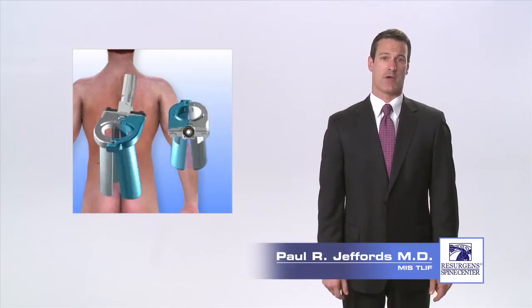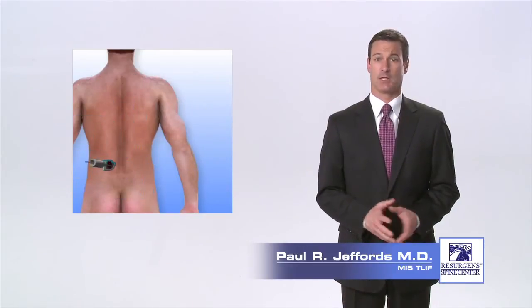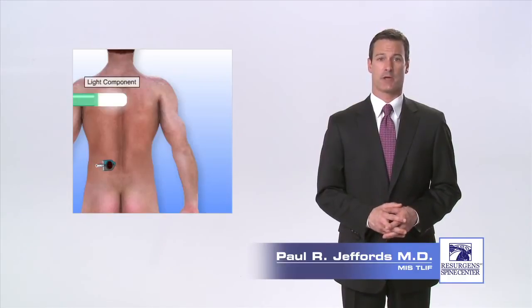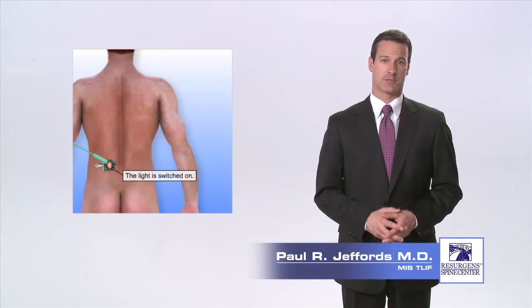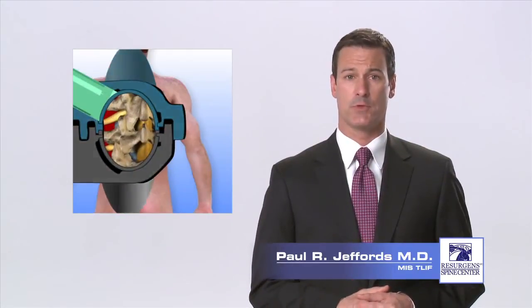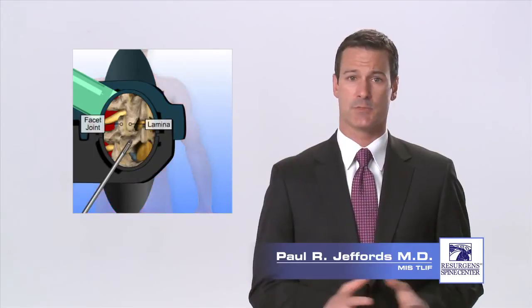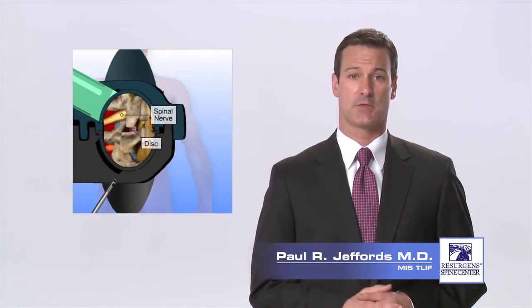A retractor is then placed over the final tube to hold the muscle tissue, and the tube is removed. A light source and possibly an endoscope or microscope may then be attached to the retractor to provide visualization for the surgeon during the procedure. Through the retractor, your surgeon is now able to remove the facet joint and any bone spurs that are pressing on the nerves. This also gives the surgeon access to the disc.